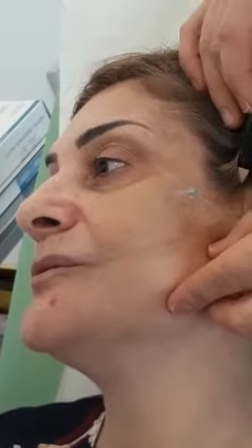Because fixation is still present, but we also work on the posterior part of the mandible. In this case, when she opens the mouth, this fixation won't be lost. So it could be an alternative, but it's not about parotid gland ptosis.